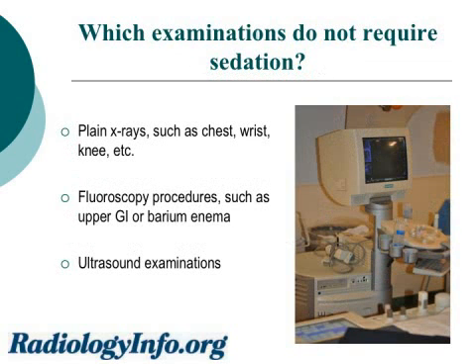What radiology tests do not require that a child undergo sedation? Plain X-rays, studies of the intestinal tract such as upper GI or barium enema, and ultrasound. Here is a picture of an ultrasound machine that can take pictures like a movie camera and does not require that the child hold very still or undergo sedation.